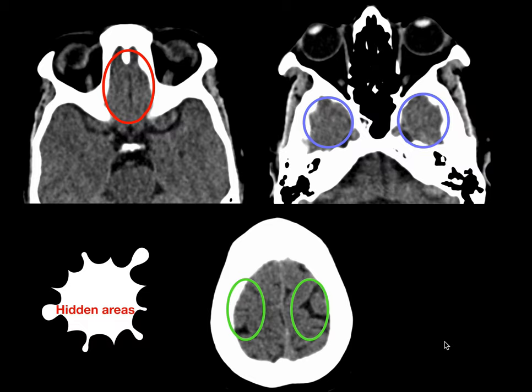Coming to hidden areas, which is the most important thing in trauma cases — there are three common blind spots usually overlooked while scrolling brain sections: the basifrontal lobes, the basitemporal regions, and the high frontoparietal convexities. Any EDH, SDH, or small hemorrhagic contusions in these regions are usually overlooked.